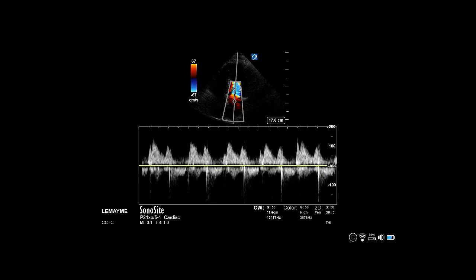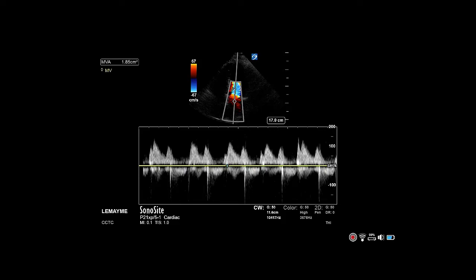Freeze your image and trace the waveform. You will need to include both peaks, which represent the E and A wave of the mitral inflow.